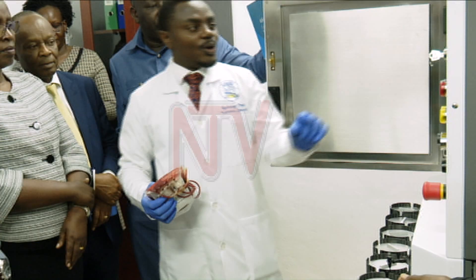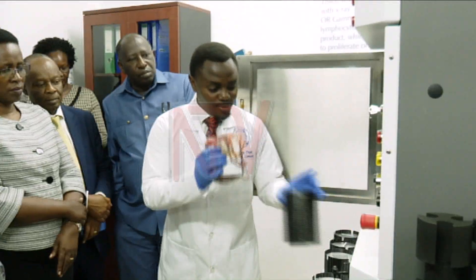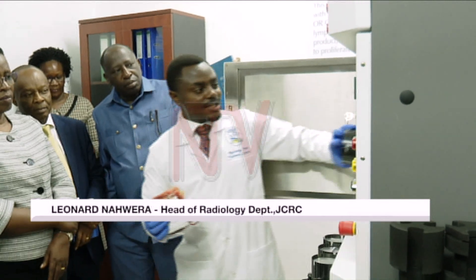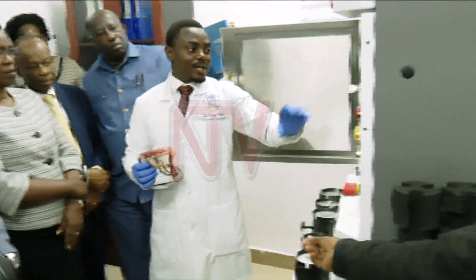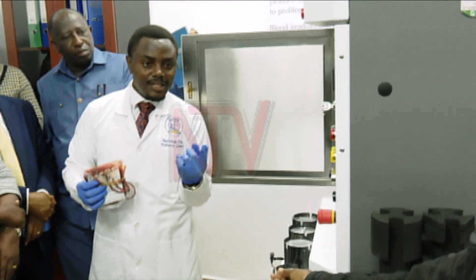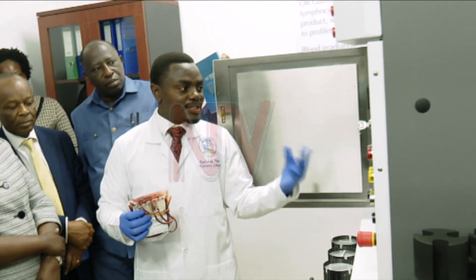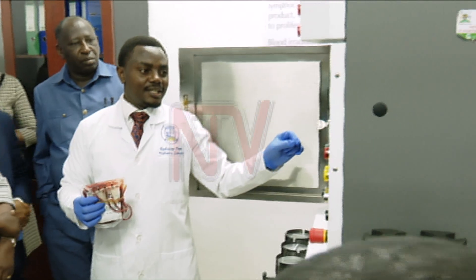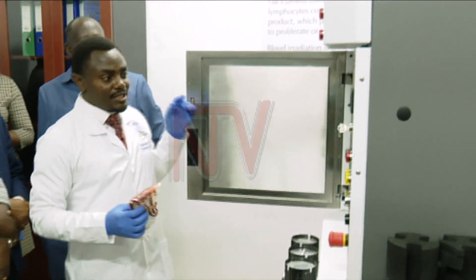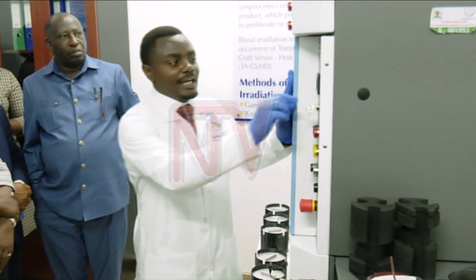He gives a demonstration of how the machine works. After pressing the product inside the canister, it is placed inside the chamber. It is locked — it does not matter where it is placed. Whether you have one unit or six whole units, you can irradiate them. Whatever you put in here is irradiated for 280 seconds.